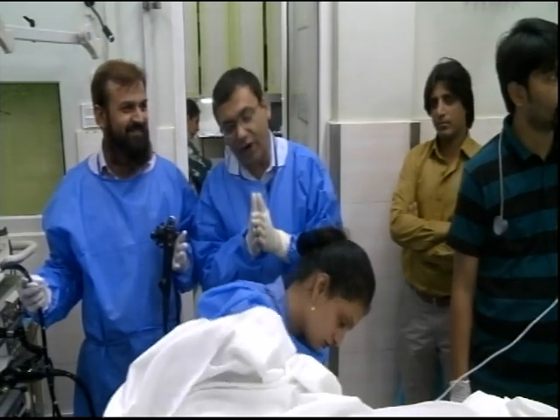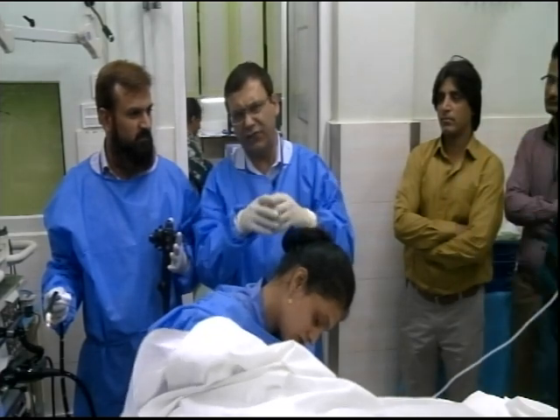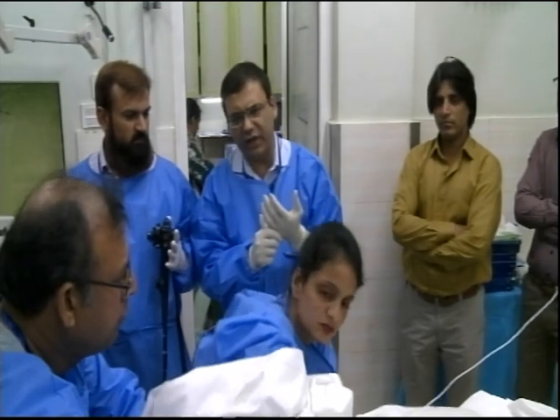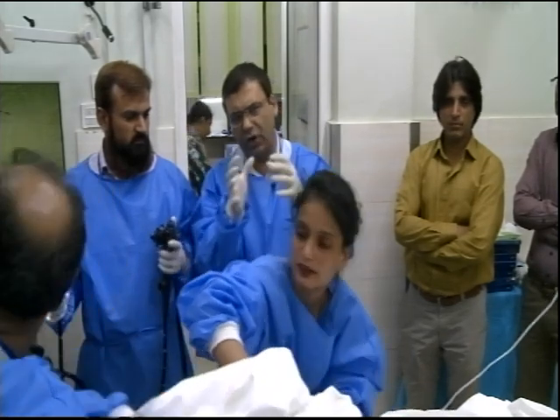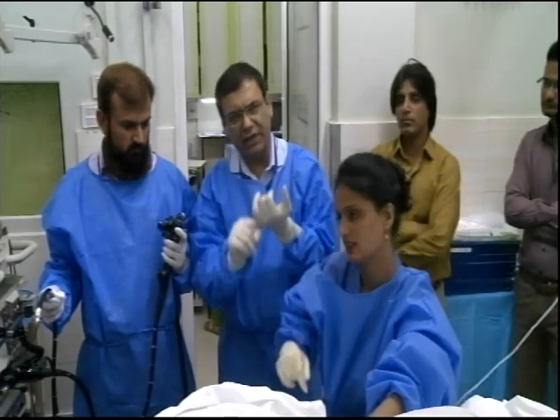So what we're going to do with this case is try to simplify. I'm going to go through the simplest way to do it. Just a few things before we start. The main goal is the pancreas here. So just remember that if you are looking at the uncinate process, that's D2.